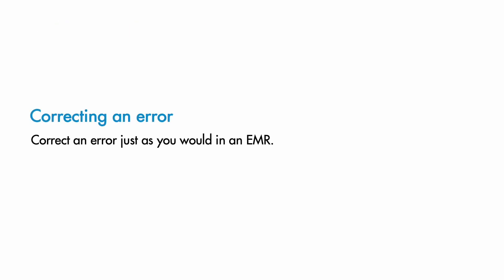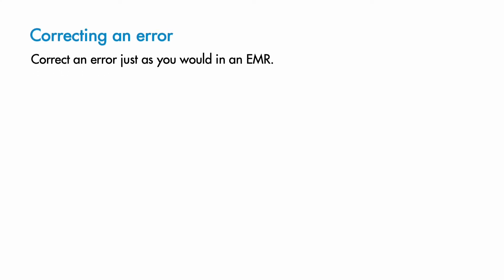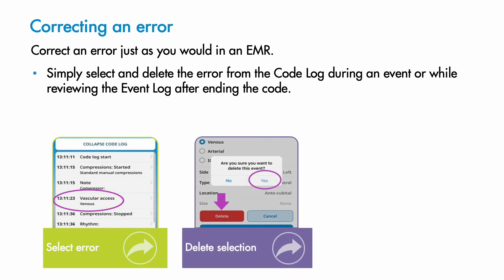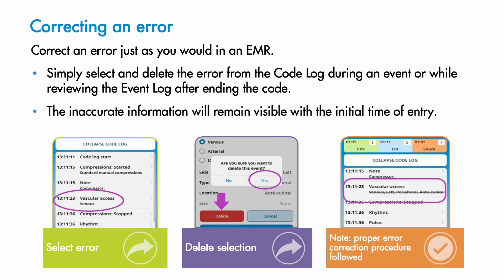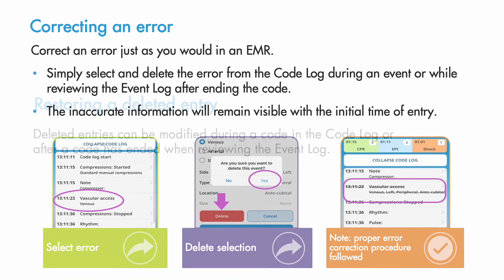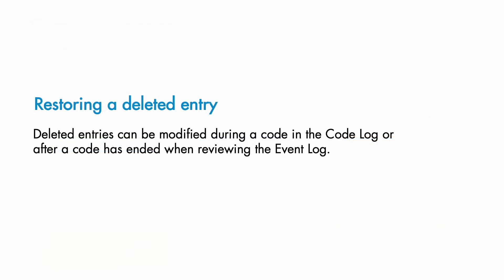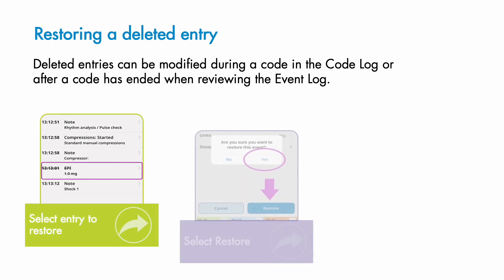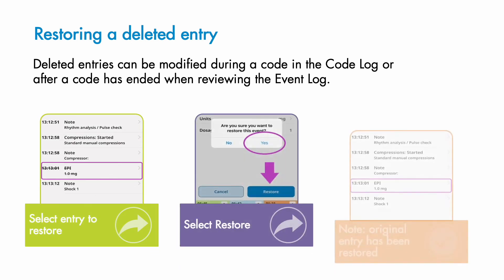Until a code is closed and uploaded, recorders can correct errors in CodeWriter the same way they are corrected in electronic medical record charting. Simply select the error in the code log during the event or in the event log after the code is ended and tap Delete. The app will ask you to confirm the deletion. Once deleted, the information and initial time of entry remain visible but now feature a line through them. Previously deleted entries can be restored by selecting the entry and tapping the Restore button, removing the strikethrough and retaining the original entry and timestamp.